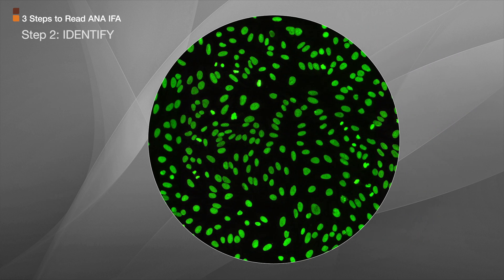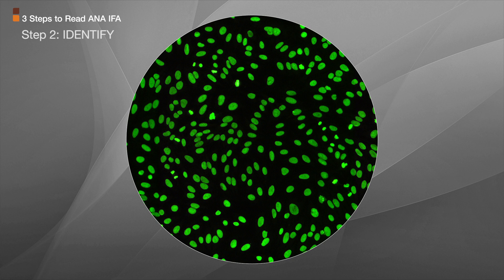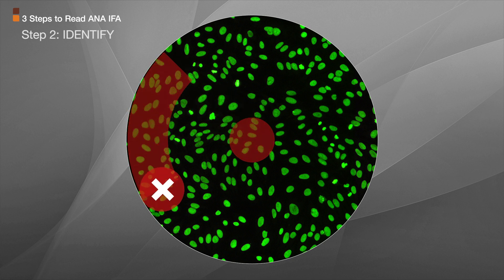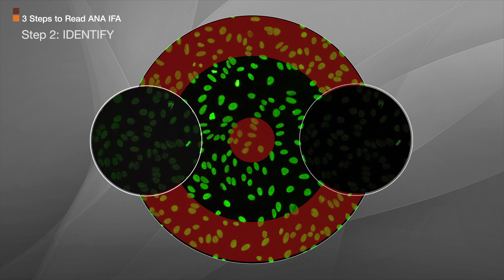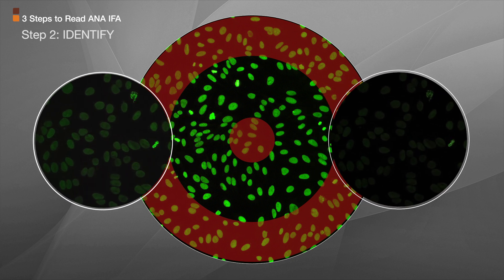Step 2: Find the appropriate reading area, which is usually one to two fields of view from the center but away from the edge. Remember, this is the most important step — determine whether the specimen is positive or negative. In other words, if you don't see a clearly discernible pattern in the nucleus of the interphase cell, then the ANA-IFA is negative.